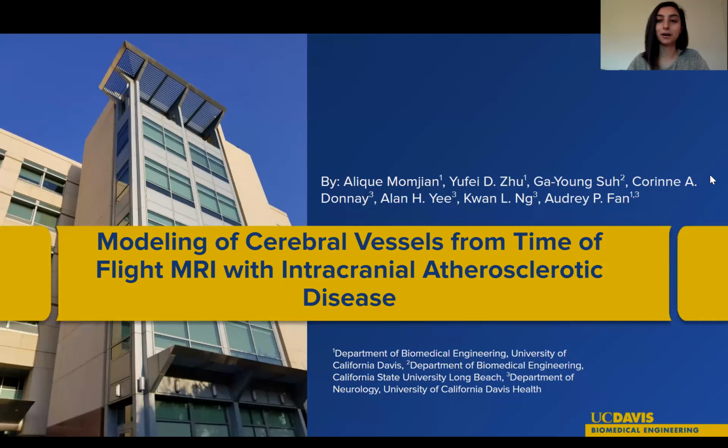Hi, my name is Alique Momjian, and I'm a biomedical engineering undergrad student at UC Davis. And my project is about modeling of cerebral vessels from time of flight MRI with intracranial atherosclerotic disease.